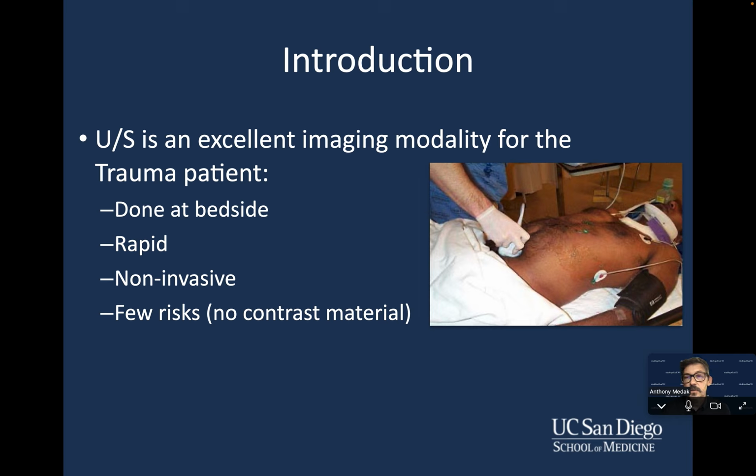And you already know a lot of the reasons why ultrasound is such a popular imaging modality for clinicians, particularly in the setting of trauma. It's very important because if you have a very sick and unstable patient, this exam can be done at the bedside. It's very quick, it's non-invasive, and it's very safe. So even in pregnant patients, you can potentially still do this technique and glean some helpful clinical information.